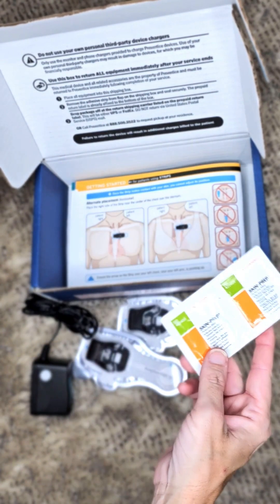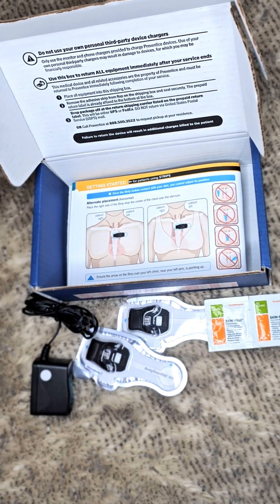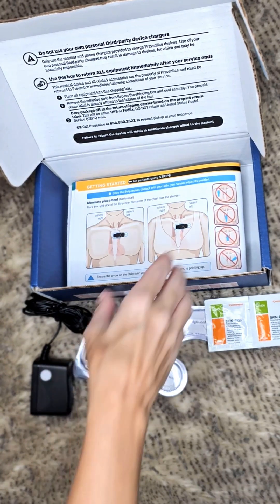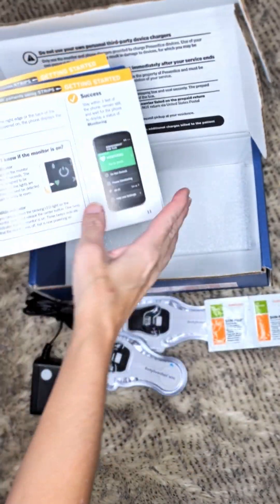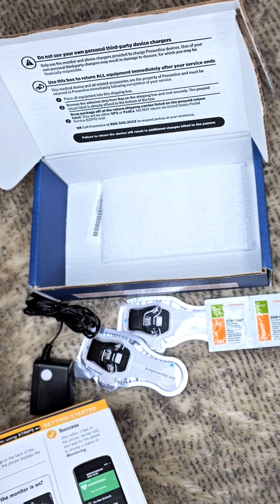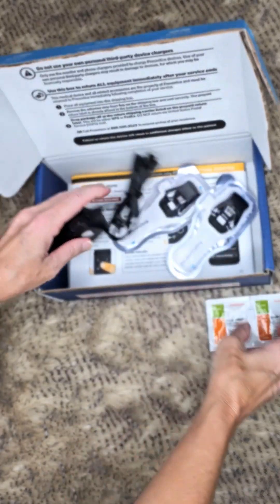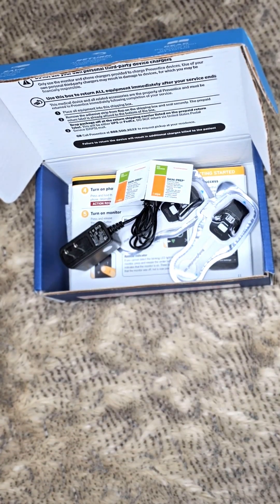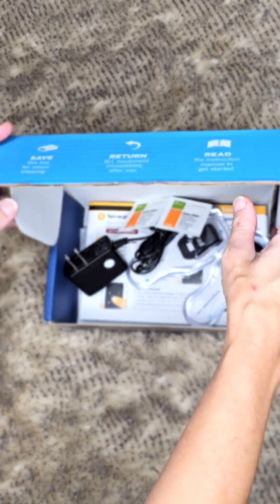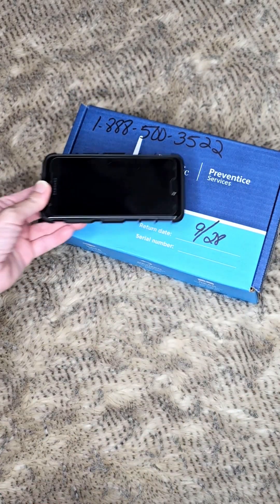It also comes with some extra skin prep to help keep it on better. When you change it, you need really clean skin — no lotion, no oils — so it sticks well for that second week. There's also a booklet for any troubleshooting, and you can call the company if you have further questions. When day 14 is done, take it off, put everything back in the box, remove the sticker, close it up, and mail it back. It's very different from what I've seen in the past — they've definitely come a long way.